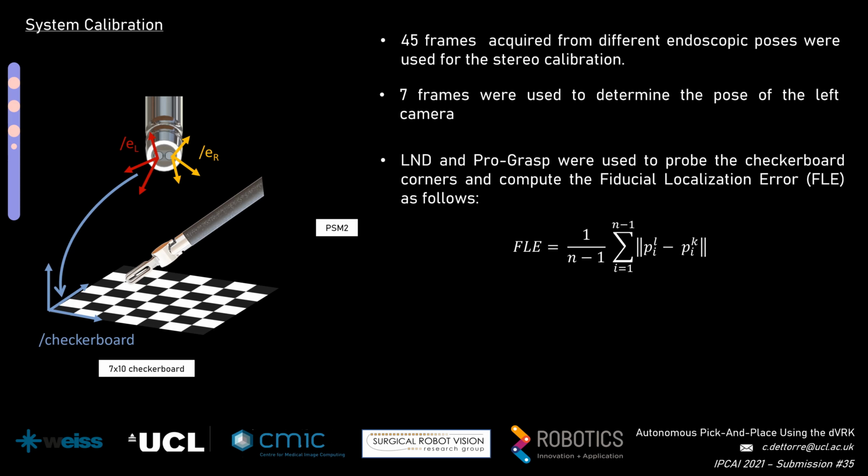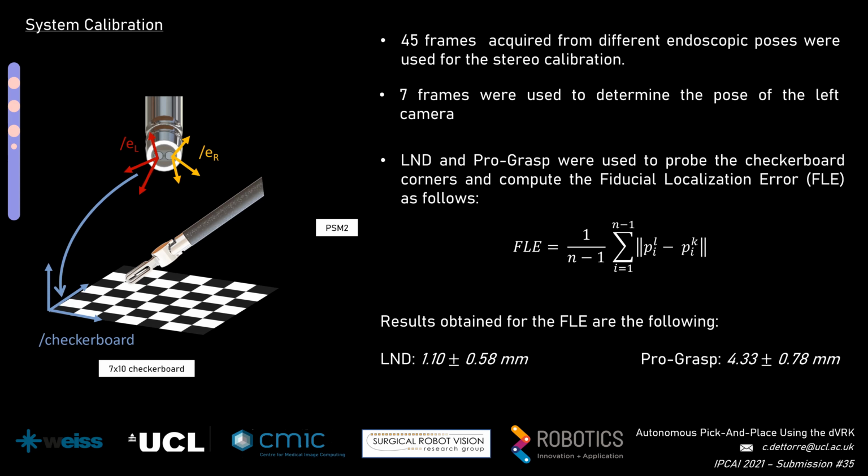To quantify this measure, we use the fiducial localization error, which computes the error between coordinates of the 2 different point clouds. The results obtained show that the large needle driver presents higher accuracy. Therefore, we selected this instrument to execute the autonomous task.